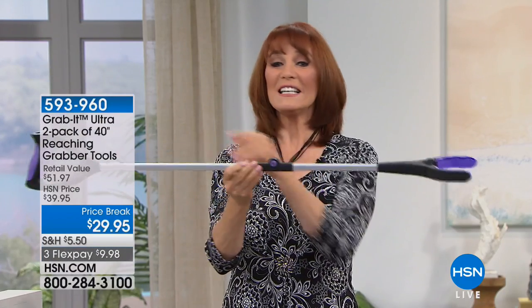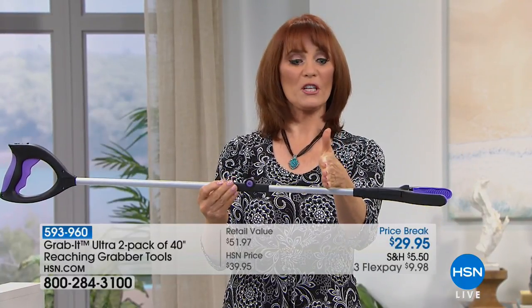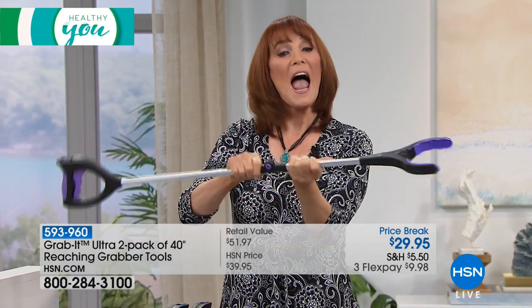Up or down you get that extra reach, and this is the deluxe which means you're getting about this much more room on your grab. On the traditional one it ends right about here, but here at HSN you get that extra reach. It does fold in half so if you want to put it next to you on your mobility chair, wheelchair, or regular chair, it'll always be with you, and of course we have the magnet.